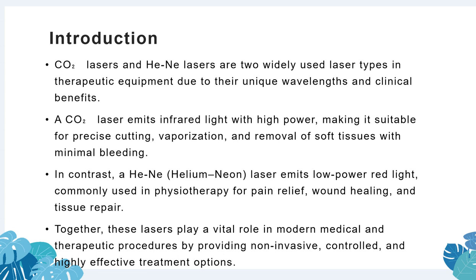Okay, then here CO2 lasers emit infrared light with high power, which makes it suitable for precise cutting, vaporization, and removal of soft tissues with minimal bleeding. In contrast, the He-Ne, which means helium-neon lasers, emit low power red light, continuously used in physiotherapy. The He-Ne lasers are used for physiotherapy purposes, for pain relief, wound healing, and tissue repair.